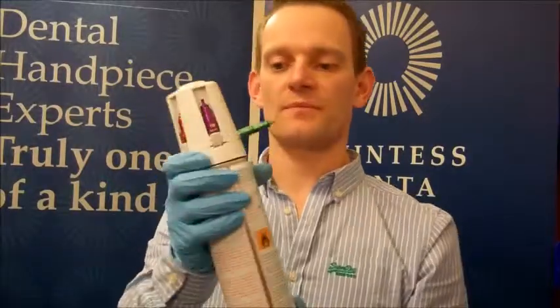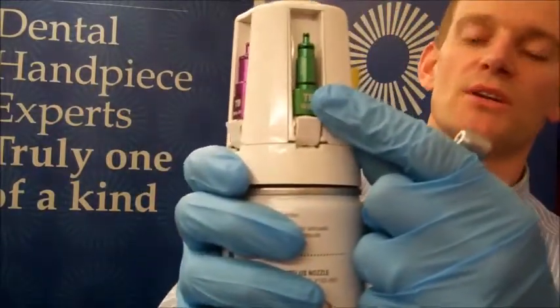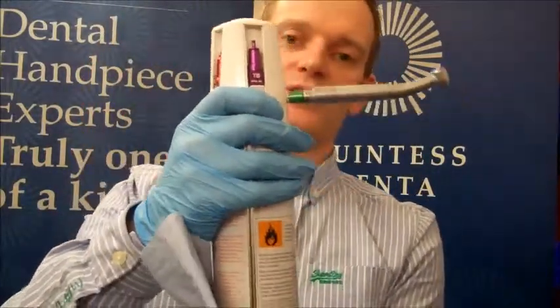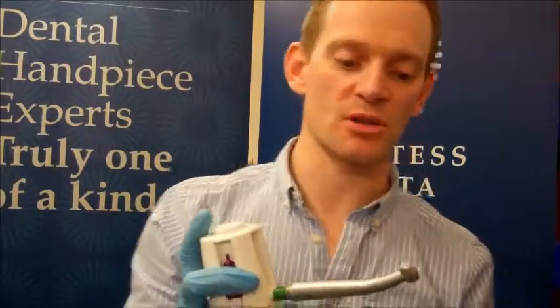So this handpiece obviously has a W&H connection. So as you can see here, this is etched W&H, so we can't mix that up. Apply the handpiece to the nozzle, and the can of oil should be sitting on a level surface again, so that we don't get the propellant gas out first. This causes contamination issues, and we want to prevent those as much as possible.